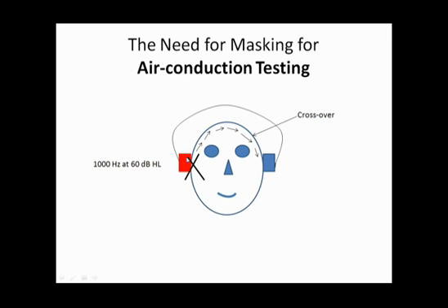So specifically, forget what I said about the airspace within the ear canal, because it doesn't matter, because that ear is deaf. It's not going to take advantage of that signal going through the TM and on into the cochlea. So the cartilage is vibrating. It also vibrates the bone and sends the signal through bone conduction to the cochlea on the other side. Again, we're presuming that the left ear is within normal limits. The hearing is good. So when the patient says, "Yes, I hear it," they're actually hearing the tone in the left ear that was delivered to the right ear through this process called crossover.